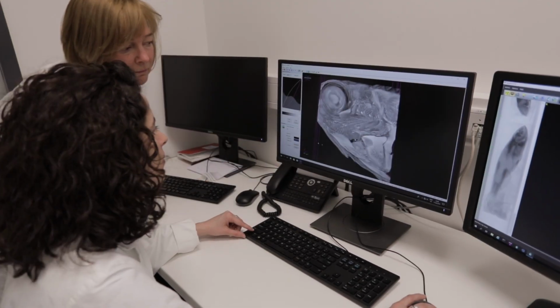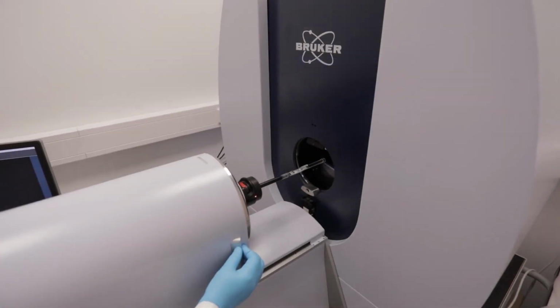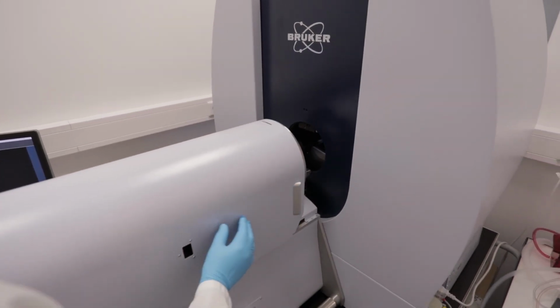It allows us to do in vivo imaging of multiple organs during the development, but it also has the ability to regenerate multiple organs, and I think this is a key advantage over other animal models that are used, including mice. So in adult stages, the zebrafish is not anymore transparent, but becomes like an opaque specimen.